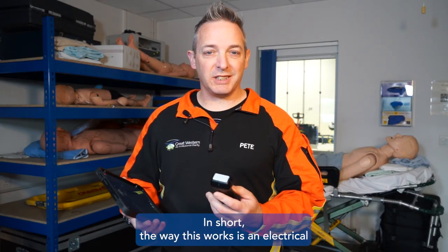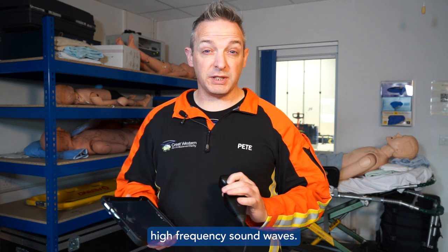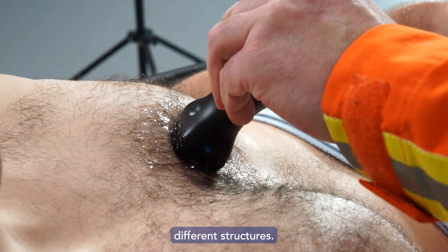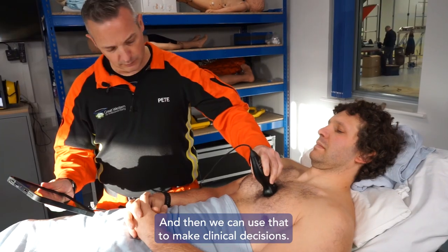In short, the way this works is an electrical current is passed through some crystals in this little handset, and it generates high frequency sound waves. And when we put the probe against the body, those waves bounce back off different structures, and that gives us a picture on screen of what's happening at different depths. And then we can use that to make clinical decisions.